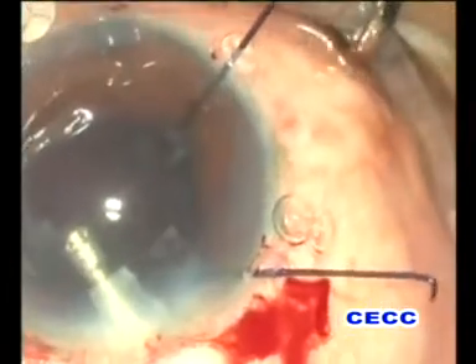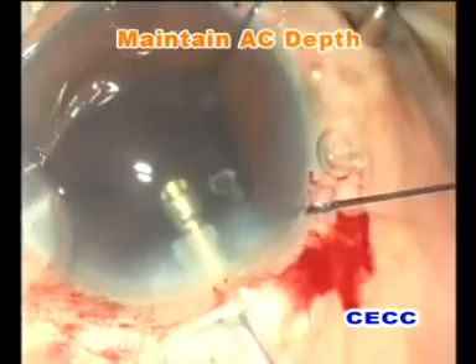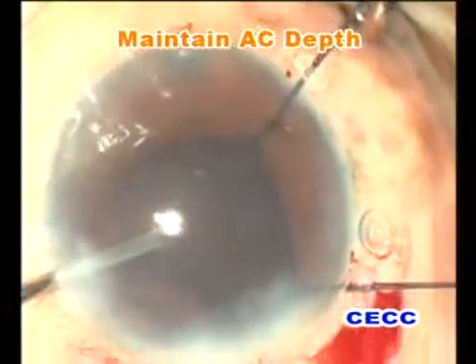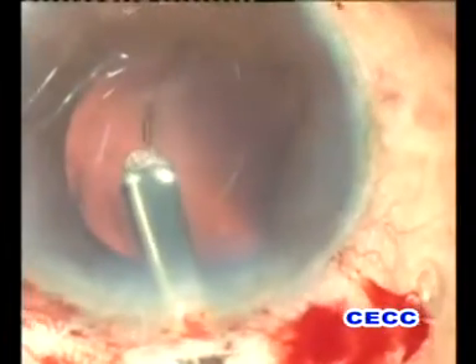Before withdrawing the phaco tip from the anterior chamber, viscoelastic was injected into it. This strategy should be followed whenever the capsulo-zonular apparatus is compromised. A capsule tension ring was atraumatically injected into the capsular bag.